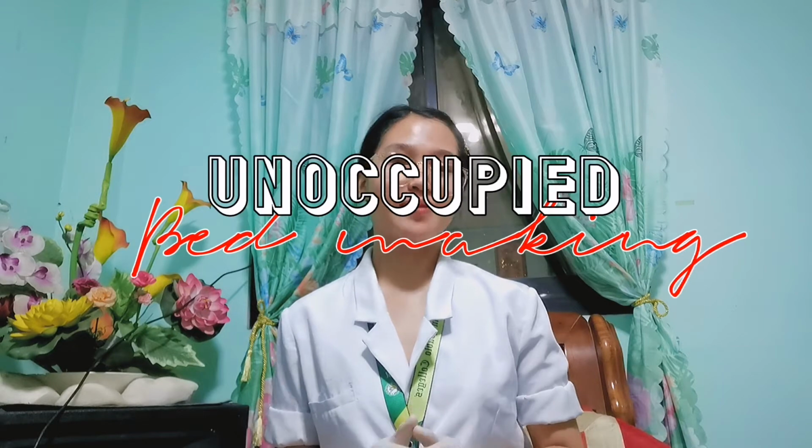And so, without any further ado, let's proceed to the procedures of unoccupied bed making. An unoccupied bed is made when the client is not confined in bed. In this bed, all linen beneath the bedspread is fully protected from dust and dirt until the admission of a new patient.